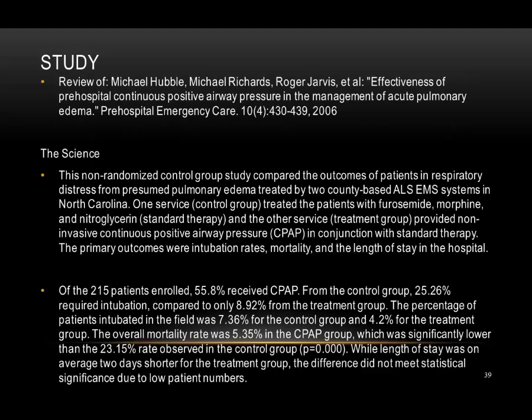This study is consistent with a growing body of research that supports the use of CPAP for respiratory distress. While this study was designed to specifically address the value of CPAP for the treatment of acute pulmonary edema, further investigation by the authors discovered that almost 25% did not have acute pulmonary edema as their final hospital diagnosis. The most common underlying conditions misdiagnosed by EMS as pulmonary edema were COPD and pneumonia.